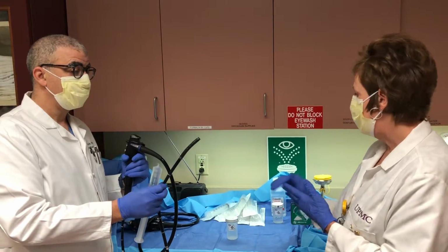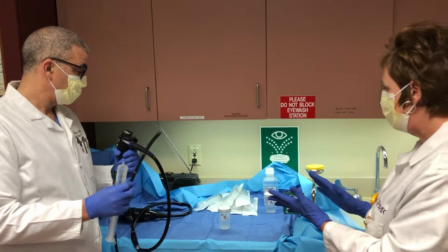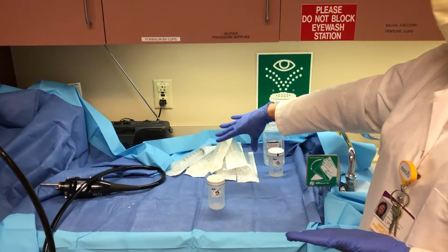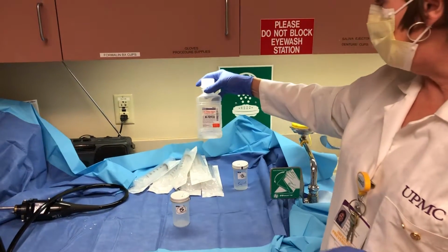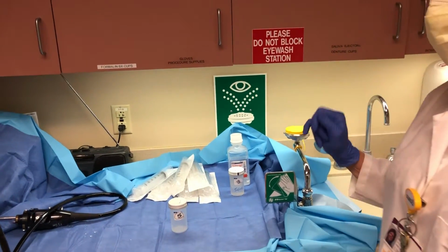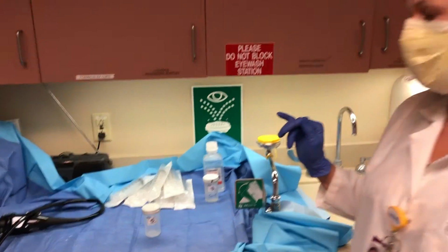So what we have as far as supplies lined up is we've got 60 cc syringes that we will be filling with 60 mLs of sterile saline that we're going to use to flush the lumen of the scope with.